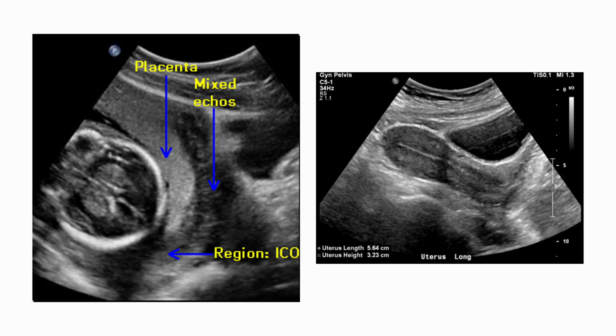That's where we are concerned that the placenta is abnormally implanting, so there's a placenta accreta possibly. And sometimes you can see it kind of growing into the bladder. Again, this is something that the sonographer would see, and then we'd confirm with an MRI, but this is the position that they look at, and the probe, how they're going to be holding the probe when they're looking at that.